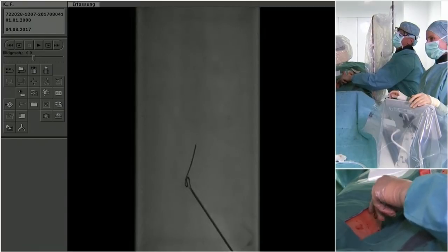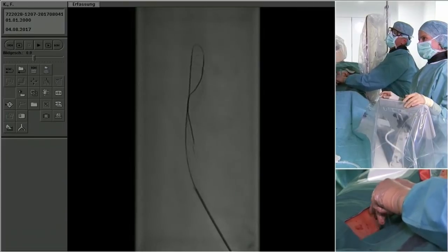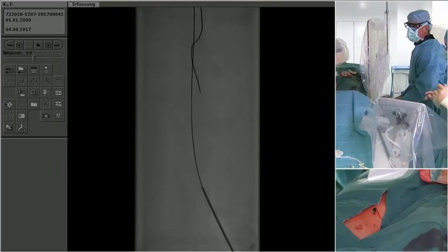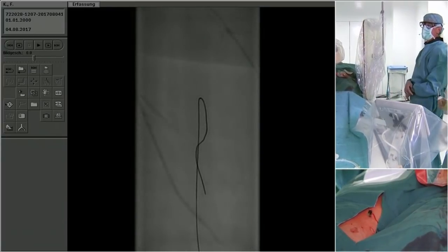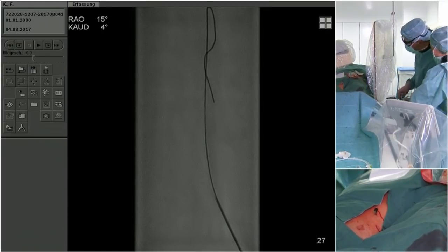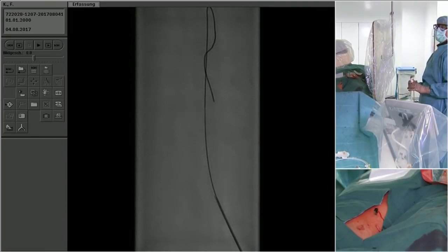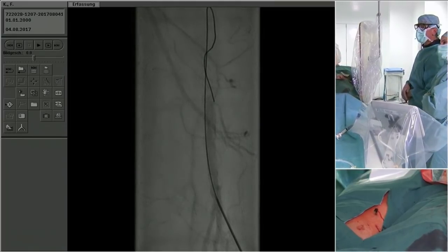So John, you see this all the time. If I was convinced I'd get across, I probably would have punctured a good segment of popliteal, recanalized, and then gotten balloon hemostasis. If I was unsure I'd cross, I probably would have gone posterior tibial. That's a good posterior tibial, low profile just across, and that way you don't have to worry about hemostasis later. This is fascinating again, watching him go into the occluded segment preferentially. He's still going to have to treat below his puncture site, so he's going to have to turn everything over, everything around.